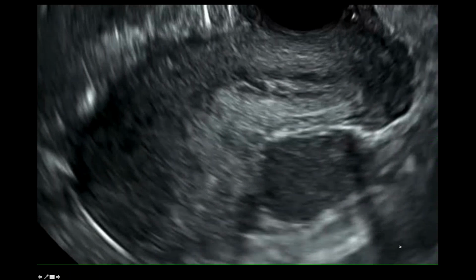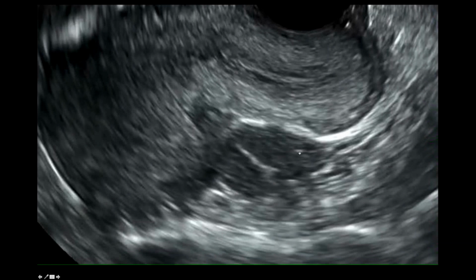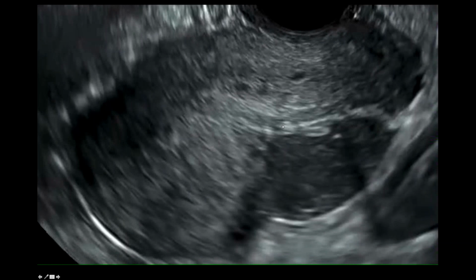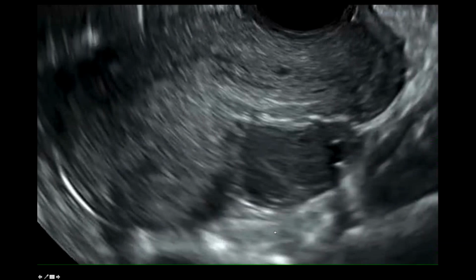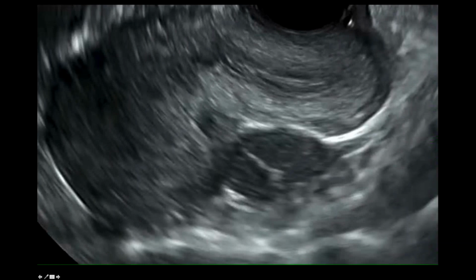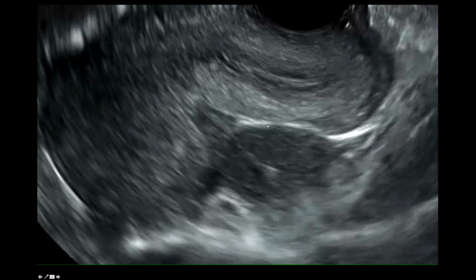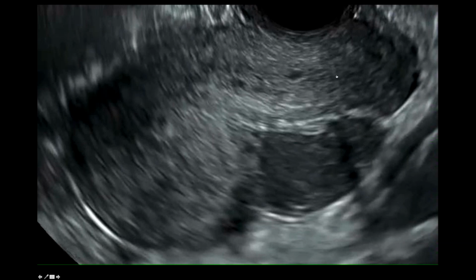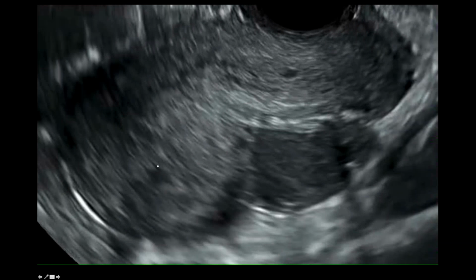What about this ovary? First of all, I noticed there's an endometrioma, and it's also completely plastered to the back of this uterus. It's not stuck to the posterior pelvis, but it is completely stuck here. See how they move as one, the uterus and the ovary? The other thing is, remember I told you about the anteverted retroflexed uterus? Anteverted retroflexed, and the reason is because it's being tethered over here.